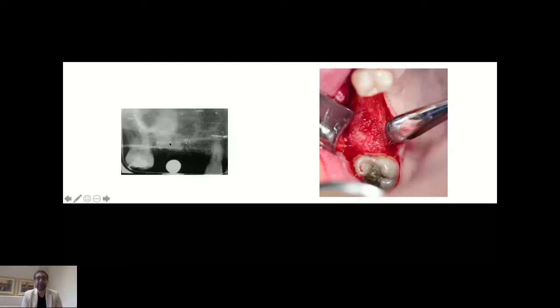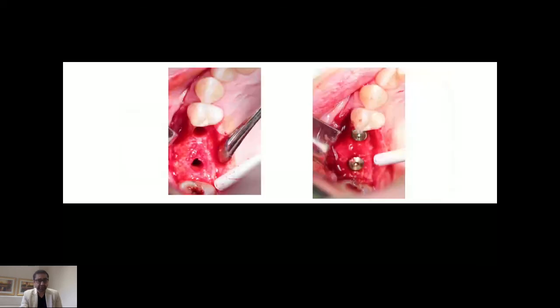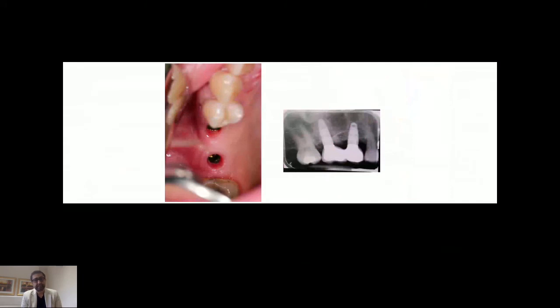This is because we planned the case properly, and we planned it before, rather than thinking about the bone loss or the lost bone afterwards. And look at the quality of the bone. Amazing. Nice, fresh, bleeding bone. Grafted, if done properly, the graft should work very well. We did the osteotomy, placed 2 implants, and look at the soft tissue healing. Absolutely amazing, hyperkeratinized mucosa all around the implants, and that's the kind of mucosa we want.